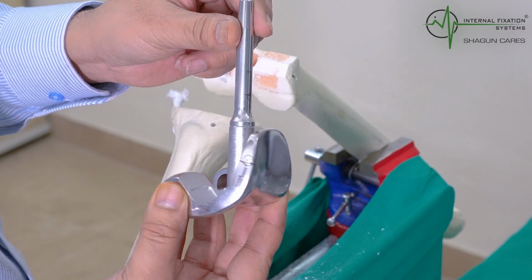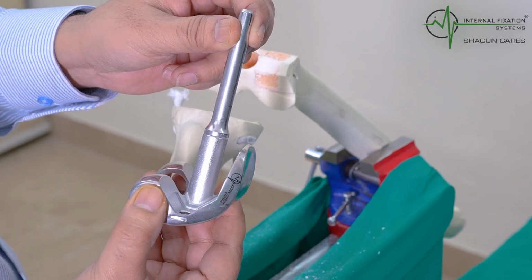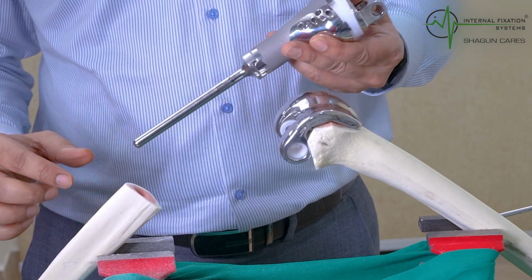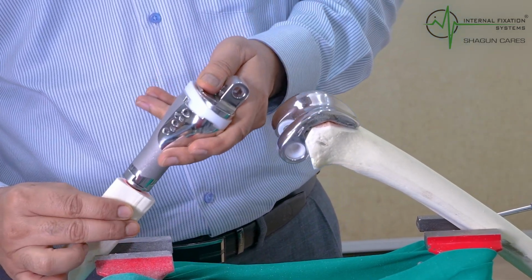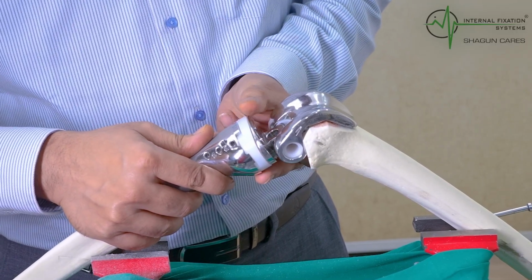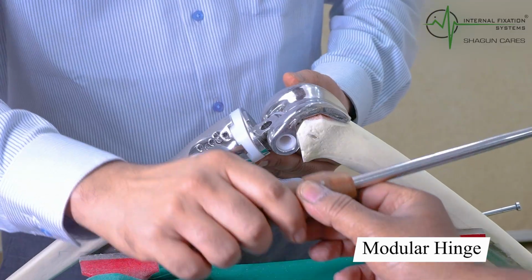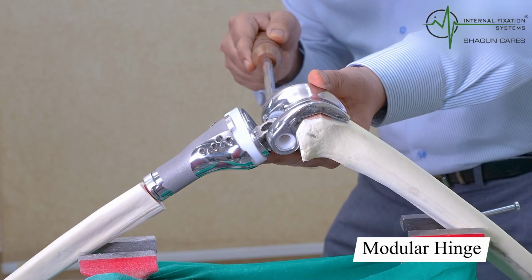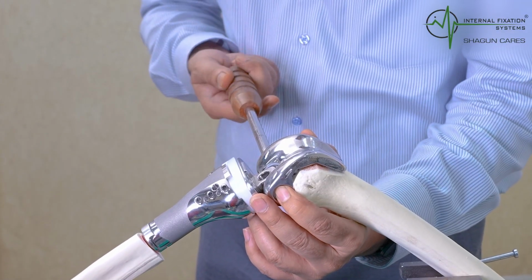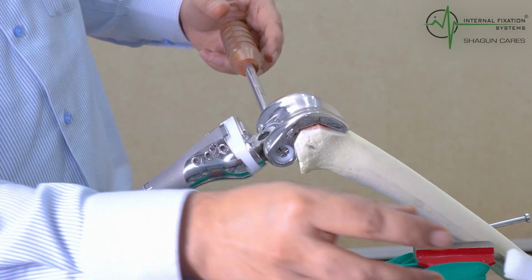So this is the femoral condyle stem, which you have in varying sizes and different lengths. We have prepared the distal femur. This is the upper tibia cut. Now we just insert it inside, and we are going to do the locking here. So for the locking, we need to put, in this we need to see that it is well positioned.